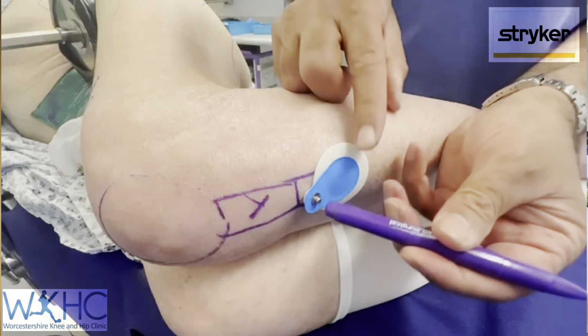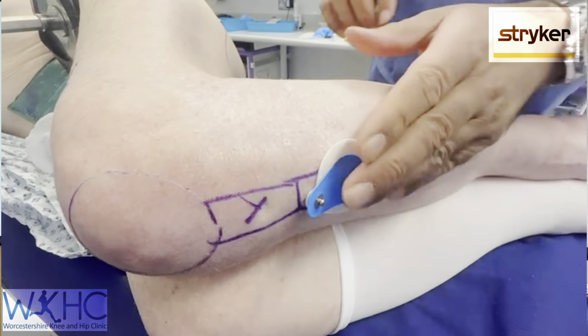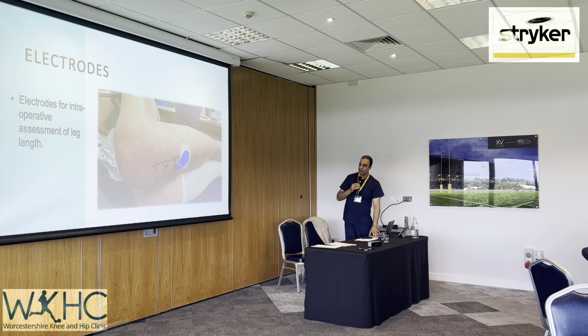Do not put it on the tendon, because look what happens when you're referencing that with a probe. If it's on the tendon, see how it goes in. So that will give you a discrepancy in your leg length, because you're going to reference your leg length off that. So that's quite important.